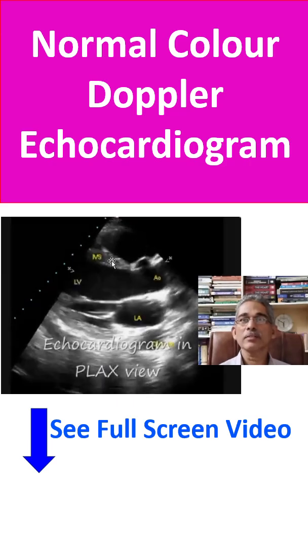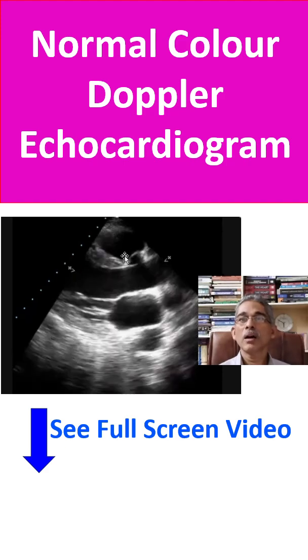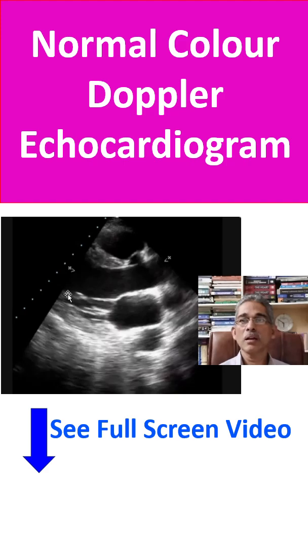This is the interventricular septum, right ventricular outflow tract and anterior surface of the right ventricle, the tricuspid valve, and the position of the transducer will be here. This is the aorta, the aortic valve is in the open position, left atrium, mitral valve is in the closed position, and this is the posterior wall of the left ventricle, papillary muscle, and cross section of the descending aorta.